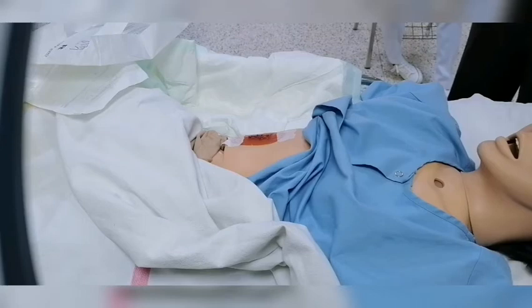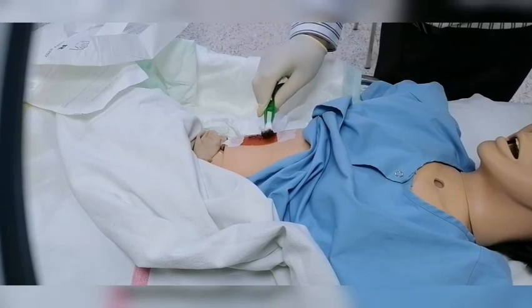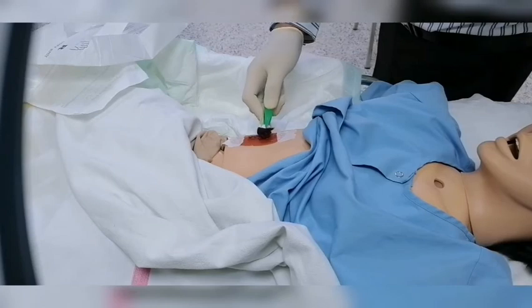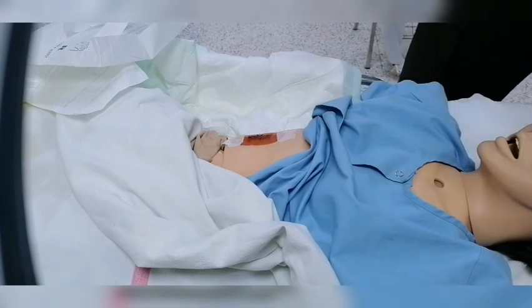I will immerse the cotton swab or the gauze swab in the solution, then with a rolling motion, starting from the center, and roll it like this. You can see me. I know that you will not be able to see well. Because of that, I am doing it.